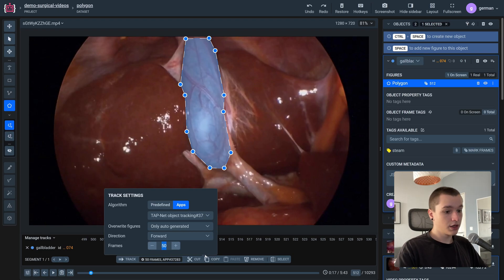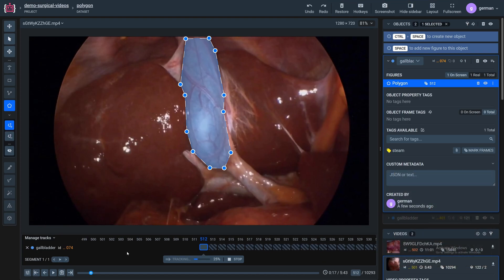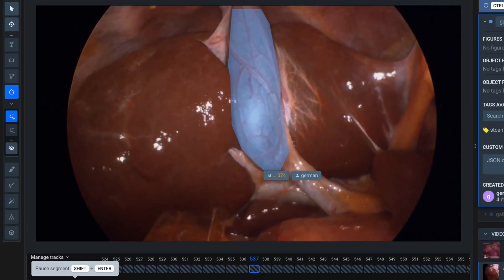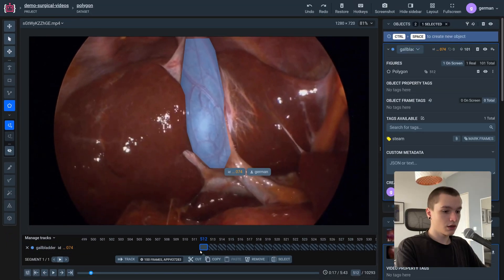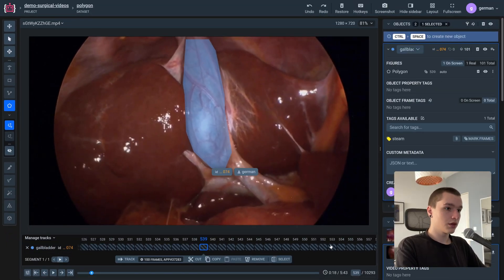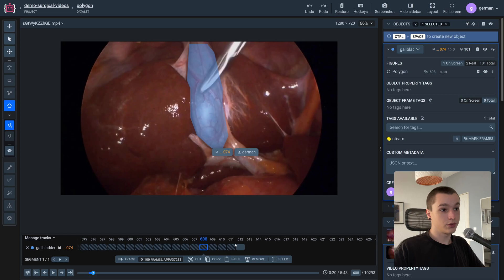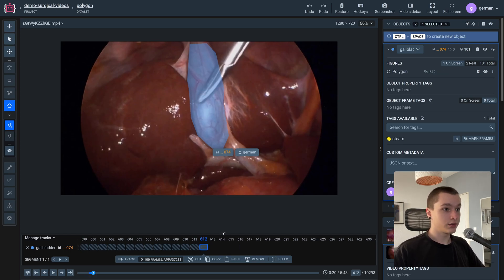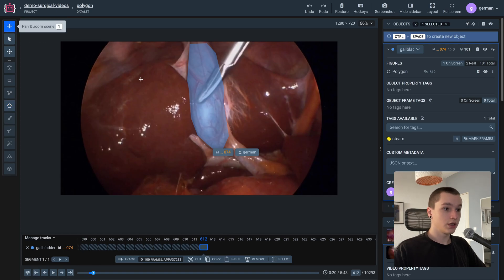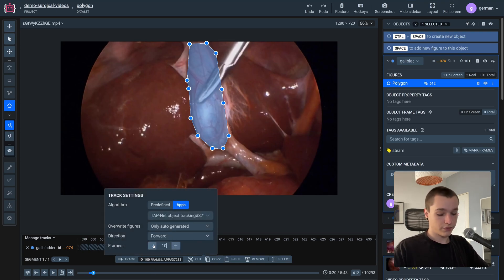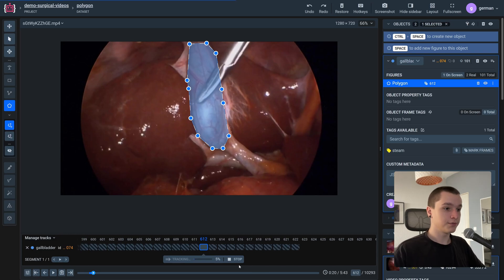I have several neural networks deployed currently — I'll go with TAP-Net. Let's do 100 frames and see how that works. As you can see it tracked pretty well, except for the parts when the knife comes into the frame, but otherwise it did a good job. If we're not satisfied with the result, we can always select the polygon and readjust it a little, then retrack — let's say 10 frames ahead — and we should get a better result.